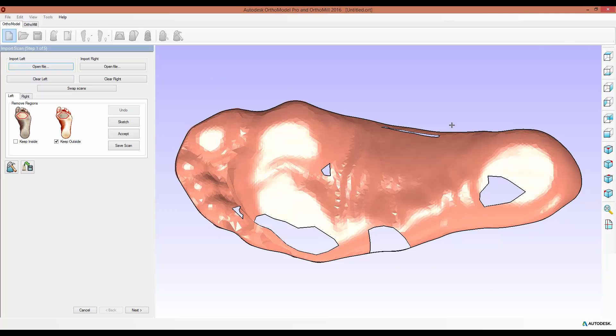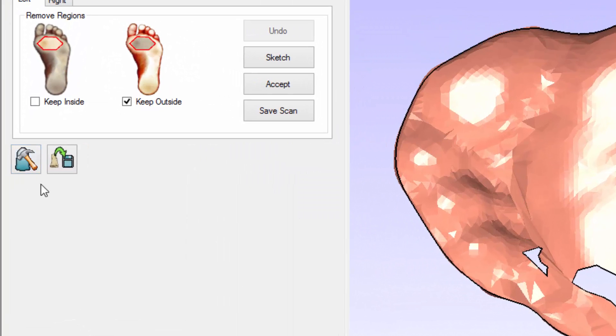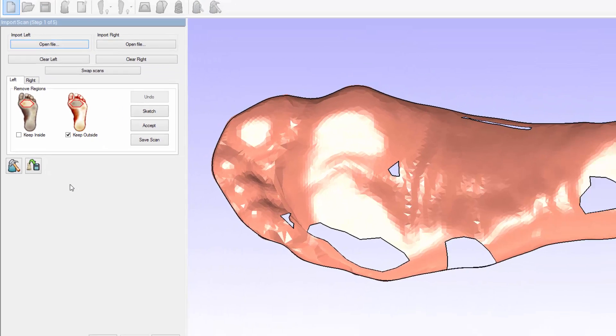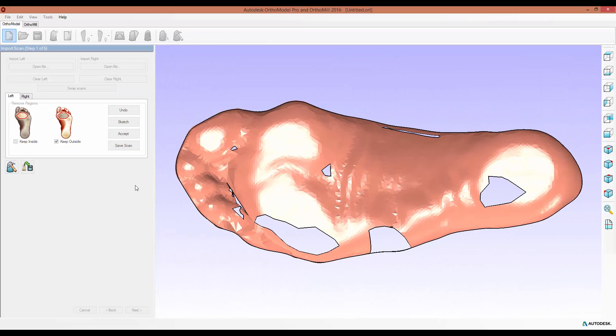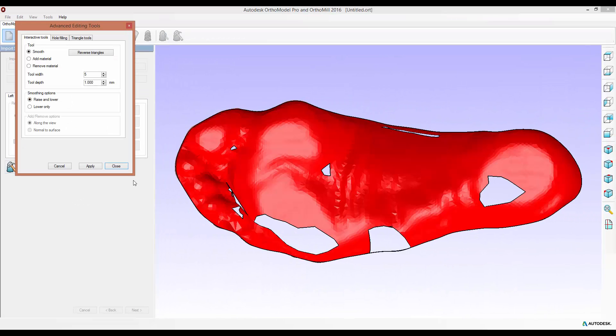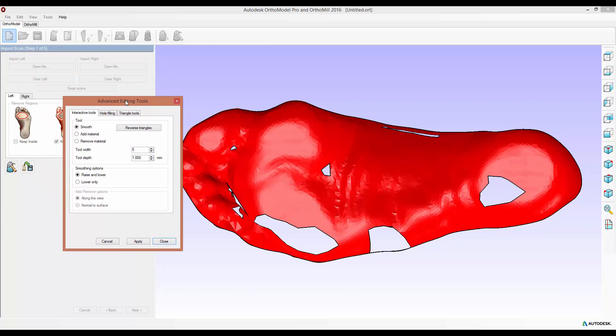You can access the advanced editing tools whenever you see this icon so it appears on this import scan step but also after you've aligned the points and you want to edit either the insole or the scan. Whenever you click it a form appears. The interactive tools tab was already there, it allows you to smooth or add or remove material manually, but the two new tabs are hole filling and triangle tools.